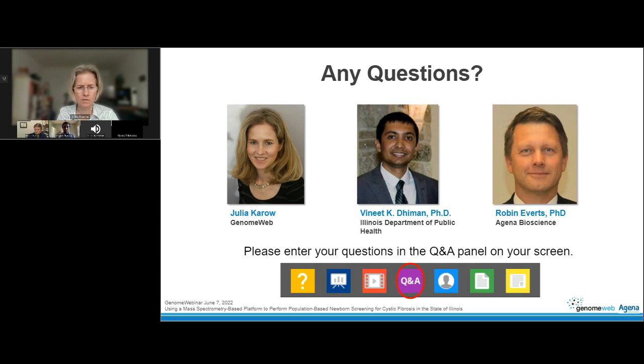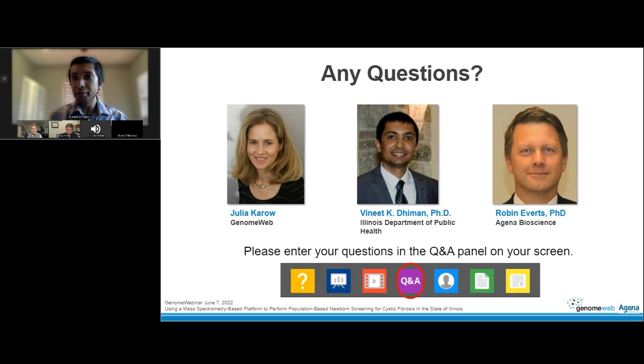Yeah, so all cards before they're even punched are visually inspected to ensure that they are properly spotted on the card, as I had mentioned in my talk earlier. As far as prior to amplification, they undergo a pretty straightforward DNA extraction using the typical QIAGEN buffers. We don't do any DNA quantification or anything.